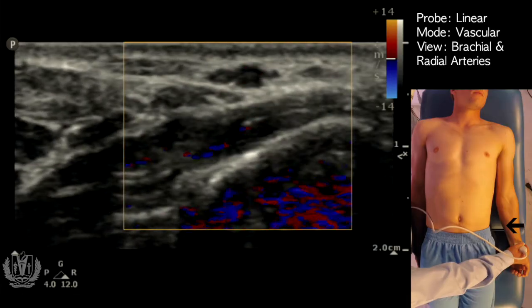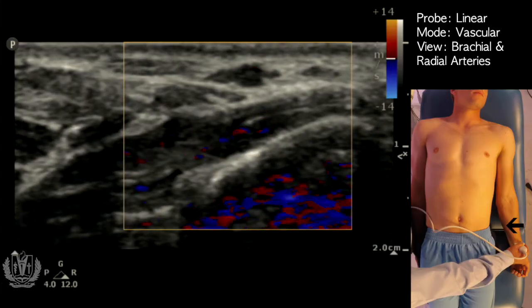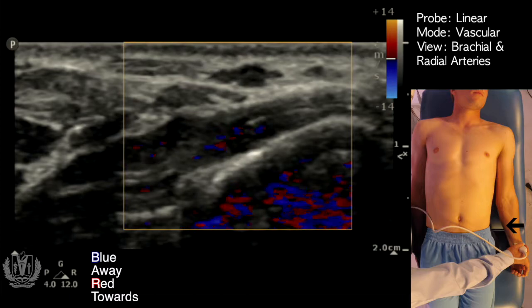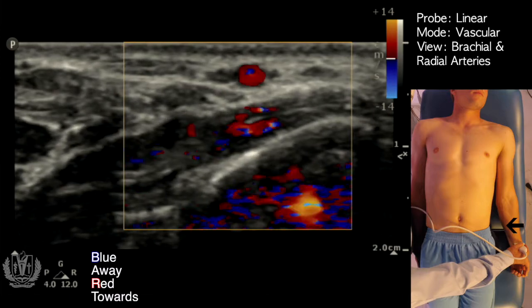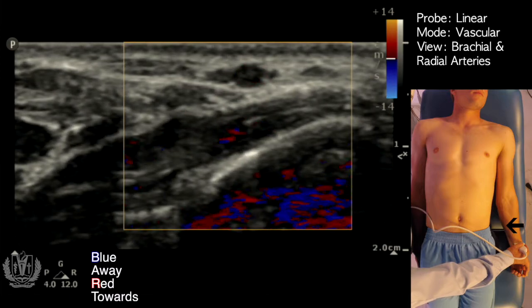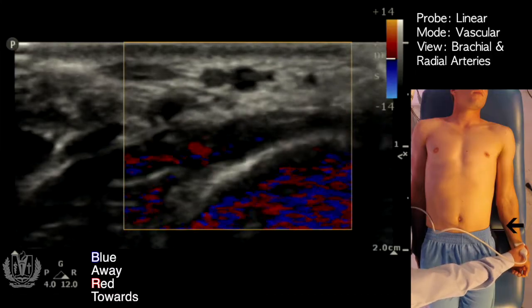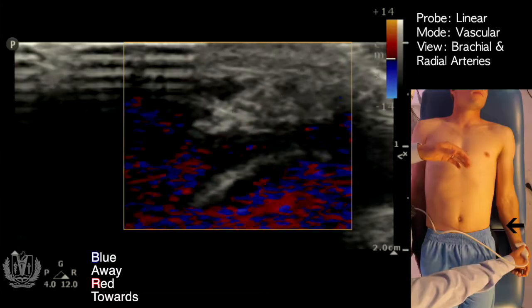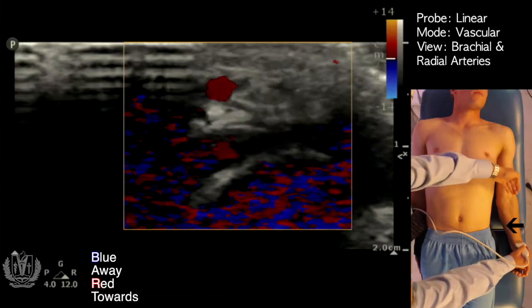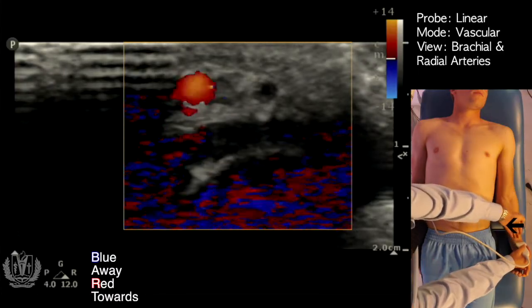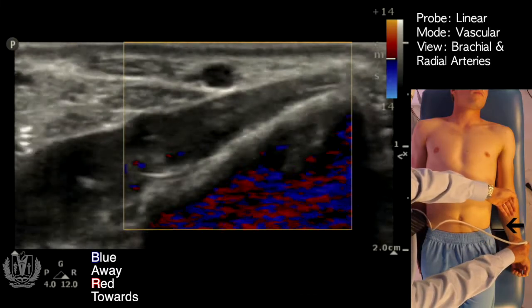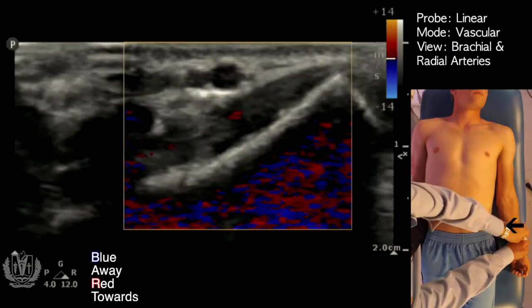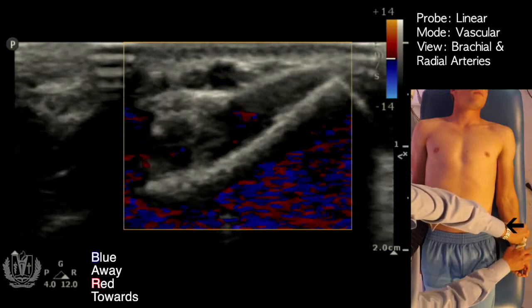If you look at the top right of the screen, red means towards the probe and blue means away. There's a concept called the BART concept to help you remember: blue is away, red is towards. So here my probe is facing this way, the flow is going towards the probe, and you can see it's red. But if I change my angle the other way, now the flow is going away from my probe and it looks blue.